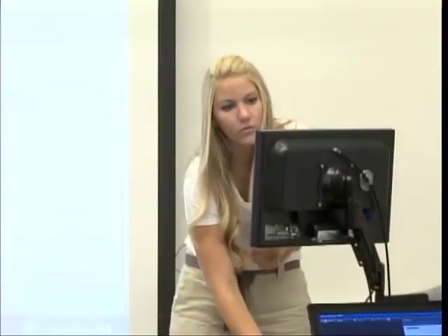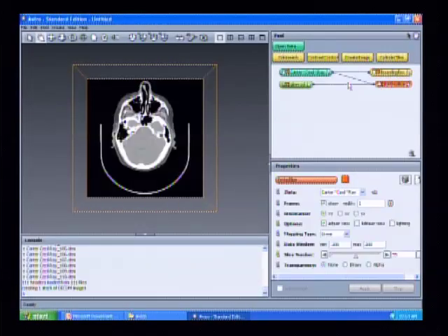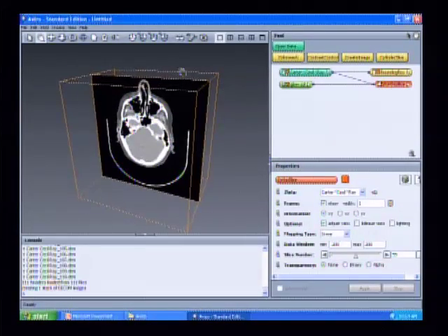But what you could do in Avizo is right-click the bounding box and right-click this Ortho Slice, and it'll bring up an image of our cranium. Normally, like I said, it would be 2,300 images long, and you'd have to scroll through. So you can play with your 3D viewer a little bit. In this properties box down here, you have a slice number.